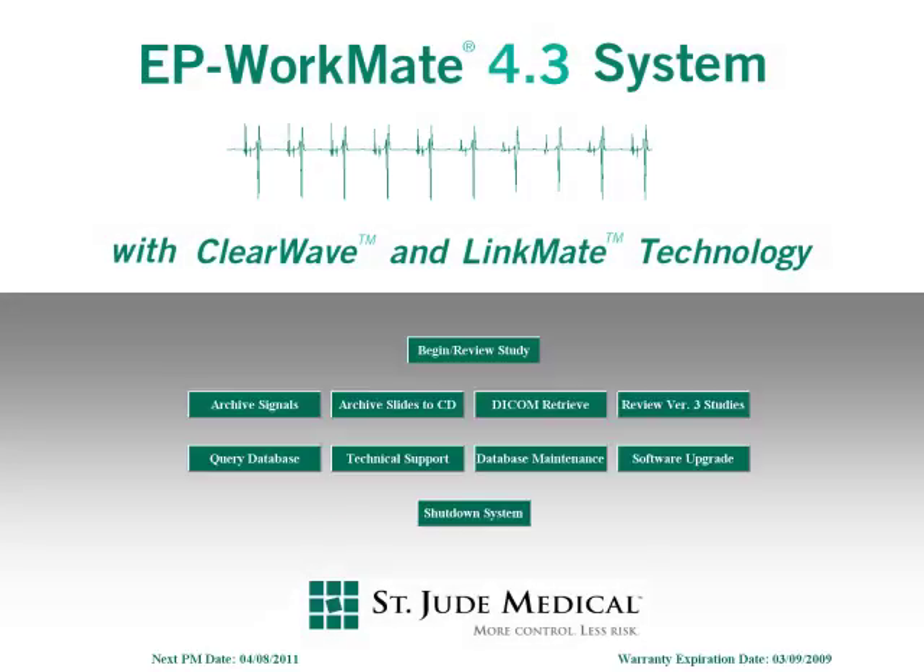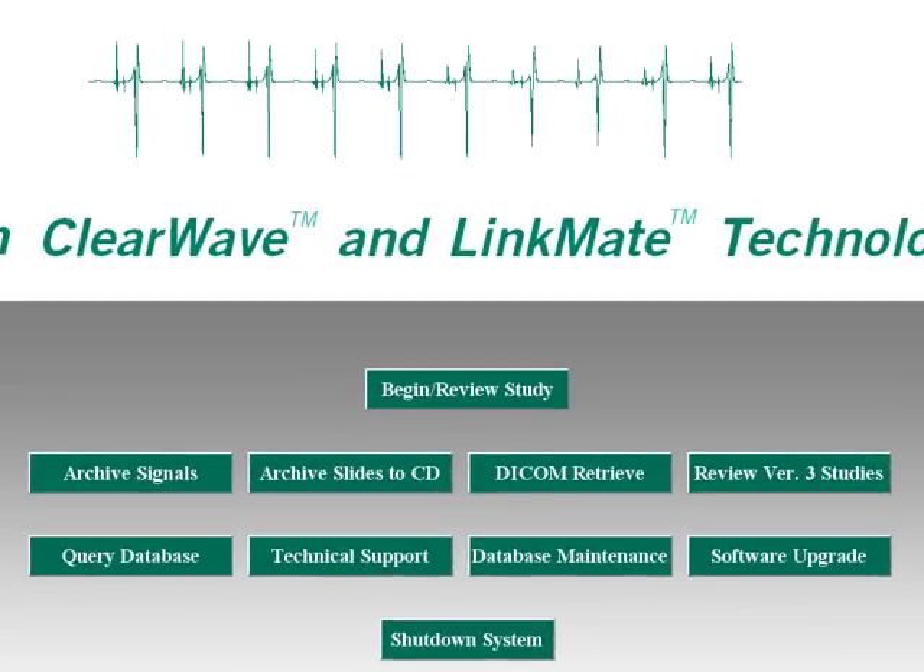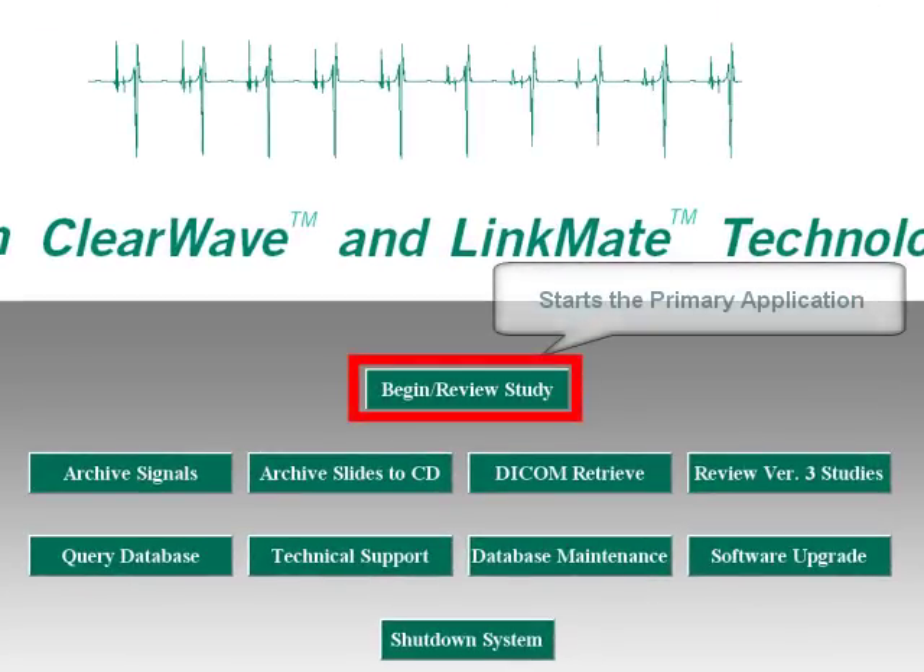The EP Workmate Recording System displays the main menu upon startup. This main menu consists of several different options, each displayed as a button. The first option is to begin review study. Selecting this option starts the primary application and starts the software so that you can do a new case or review an old case.